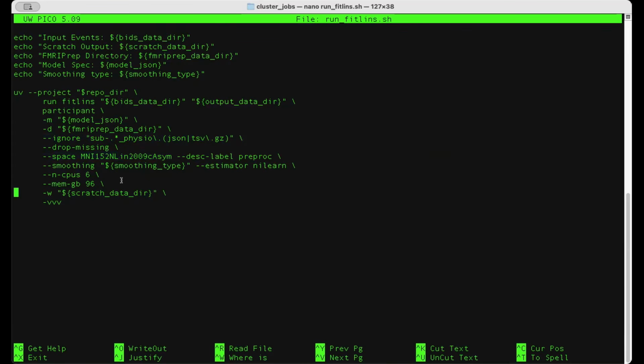But I'm adding some things for quality control to visualize what counts there are. So you have an idea like, hey, everyone has this. At each step, when you run them, it does spit out a report like, hey, this subject has only one run, but you're expecting some people have two. So try to iterate at each step so you're aware of what is missing, so you don't add subjects that don't have trial types. But yeah, it drops subjects if they're missing or runs if they're missing. Good question. Thanks for that.